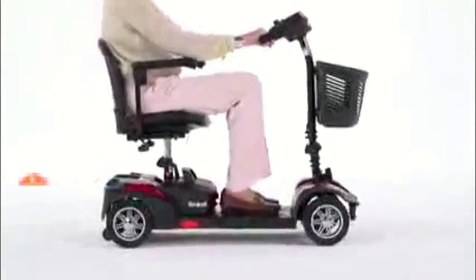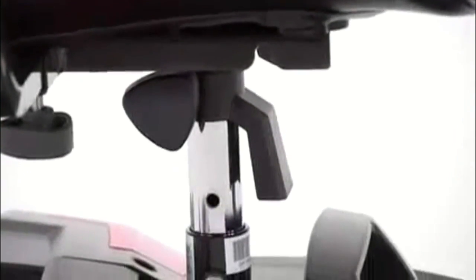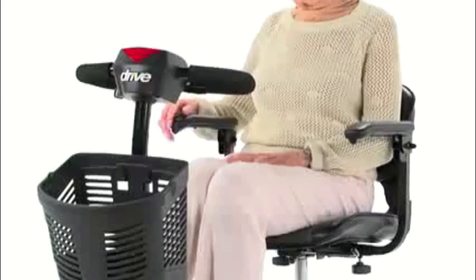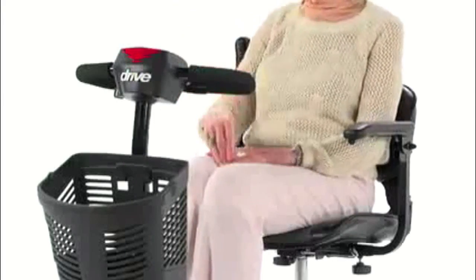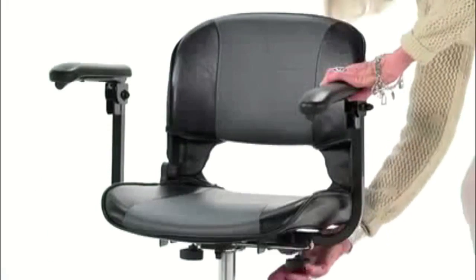the Spitfire Scout Deluxe offers excellent comfort. The upholstered stadium-style seat can swivel 180 degrees, and also has three height selections to suit users of nearly any height. The padded armrests flip up for convenient boarding and exiting of the scooter, and the armrest width can be adjusted to best fit the user.